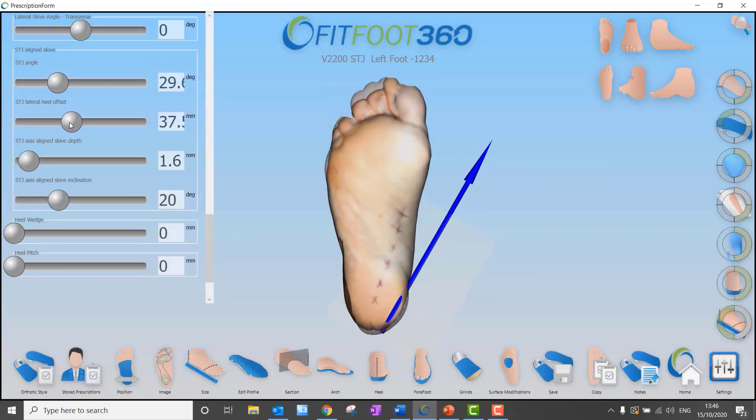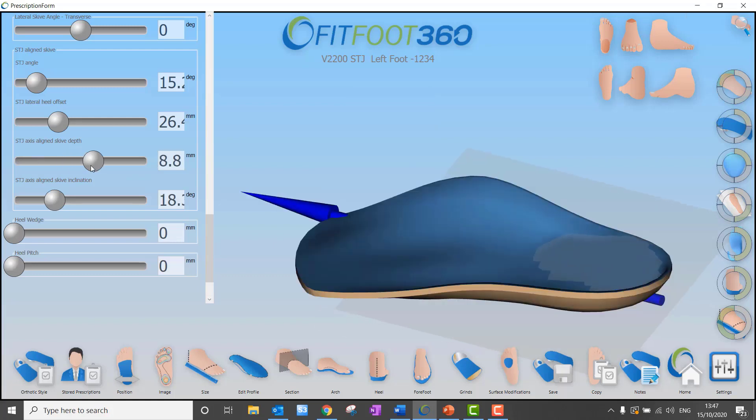We've always had skives in Fitfoot 360, but this new skive allows us to control the axis of force through the foot by aligning to the subtalar joint, giving us a very controlled skive. This is a new feature in version 3.